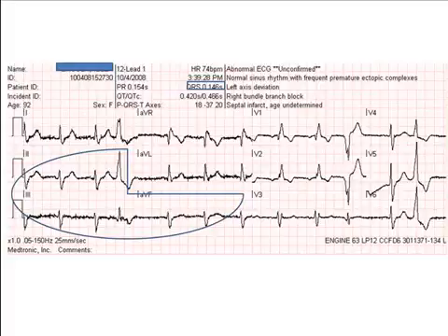Now we are deciding if this patient qualifies as a STEMI. Nope, there's no evidence of a STEMI, and if there was, we have already identified a potential mimicker, a bundle branch block. So let's look at V1. The terminal complex before the J point is an upward deflection. Therefore, this would have been a right bundle branch block and not an indicator of a mimicker.